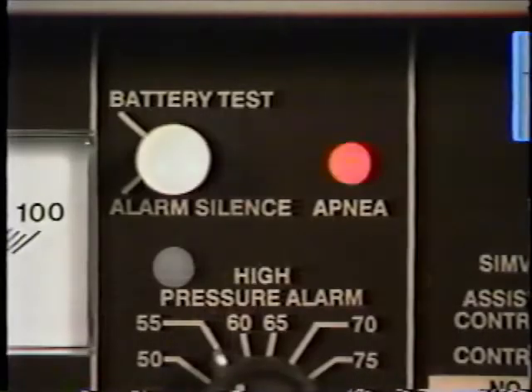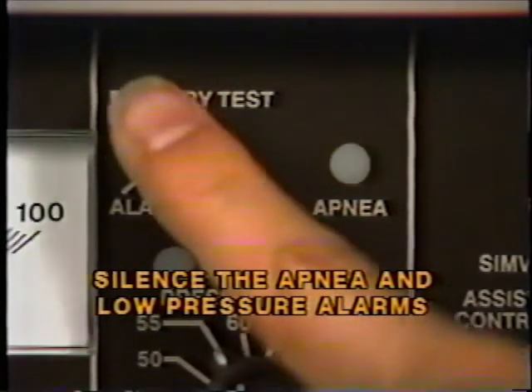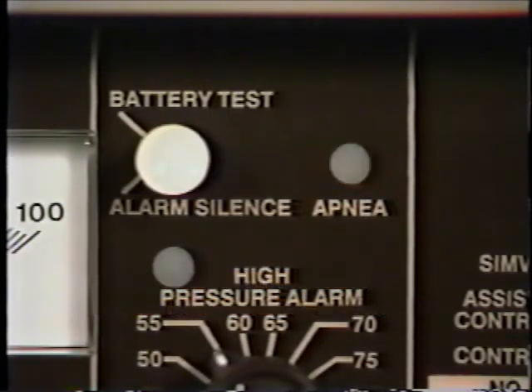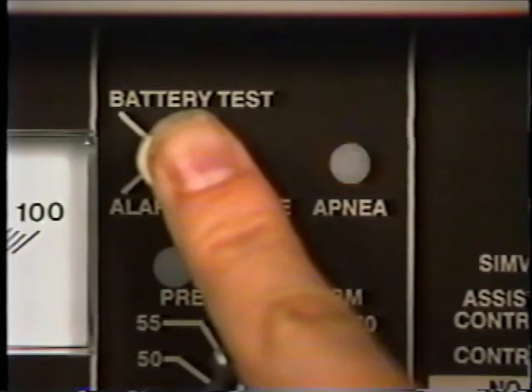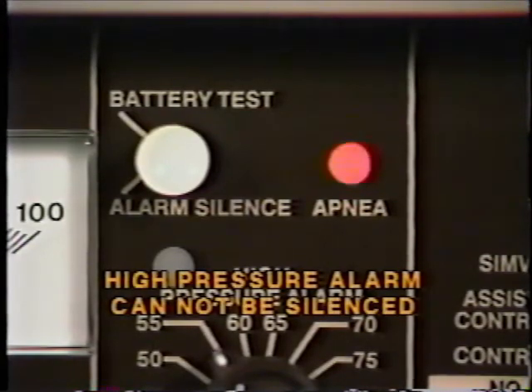The apnea and the low pressure alarms may be silenced for 60 seconds by pressing the silence button. When silenced, the apnea and low pressure indicators will remain on. To reset the alarm before the 60-second silence period has elapsed, press the alarm silence button for approximately 3 seconds. For patient safety, the high-pressure alarm can never be silenced.